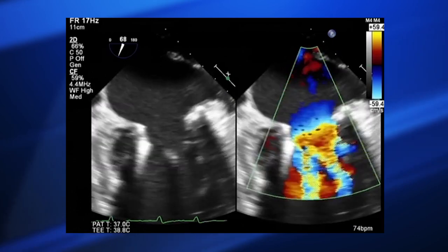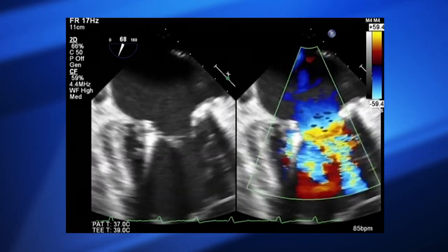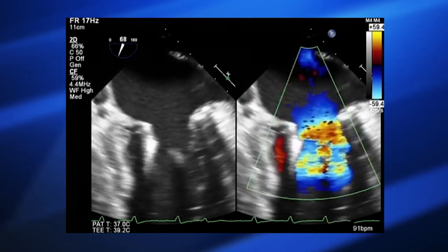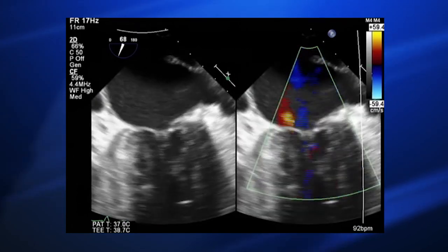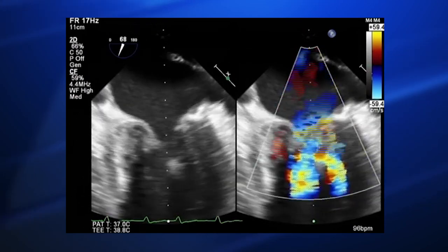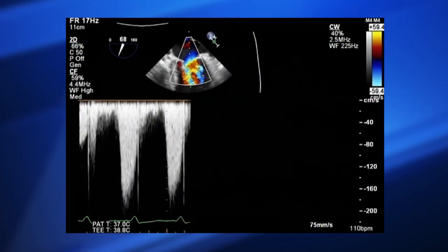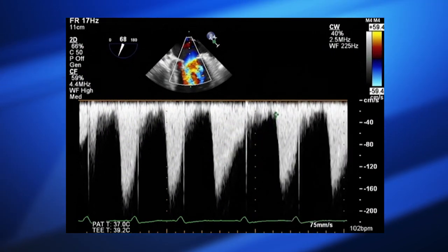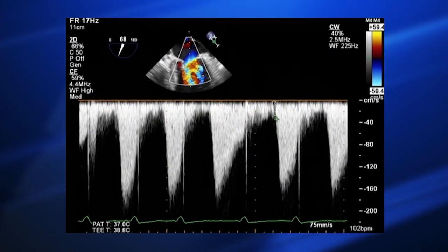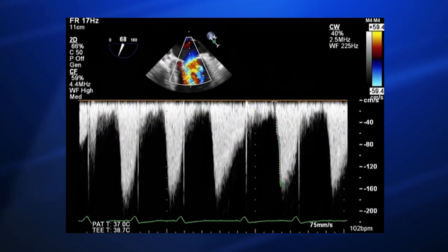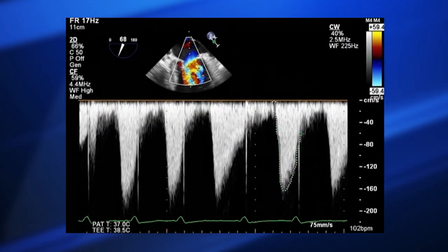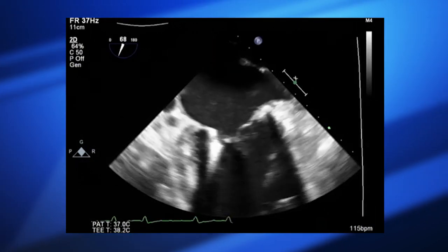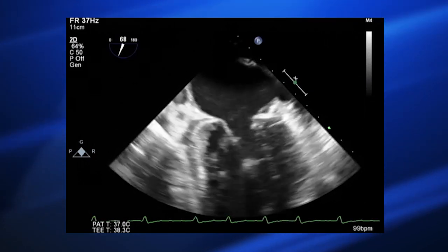Looking at the valve, we can see the clip is where we positioned it on the medial aspects of A2 and P2. The residual colour is predominantly lateral to that, just adjacent to A2 next to the clip. We'll check our gradients — obviously we don't want to cause important stenosis. Continuous wave through the orifice — he's in AF so we'll do some averages. An acceptable gradient at this stage.